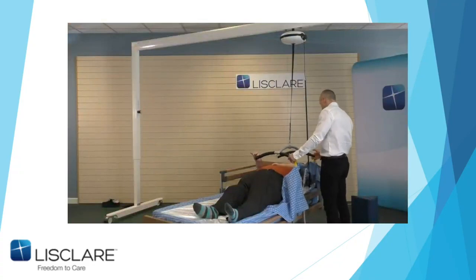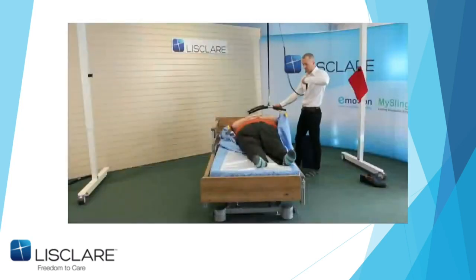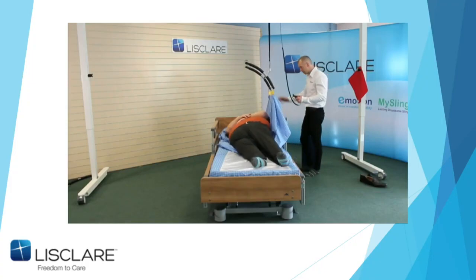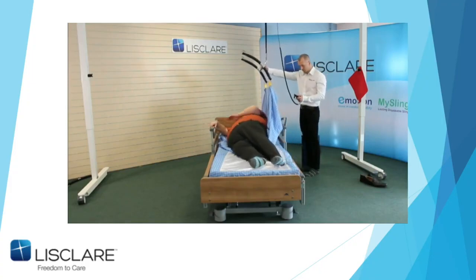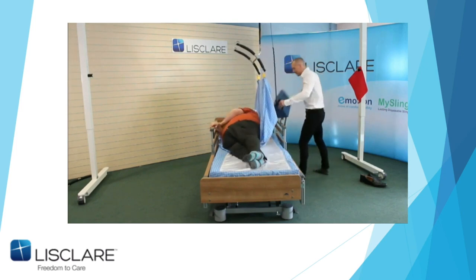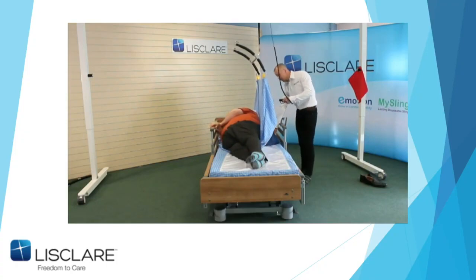Just to show you that once this goes, you go. Up you go, John. I'll just get the wedge ready when you're just behind the jump. This is designed to do this, so don't panic. That spreader bar will turn up like that. And you can see naturally, I'm going to try and push and shove. That's you, John. I'm turned. At that point, John can put the wedge in and lower it down.